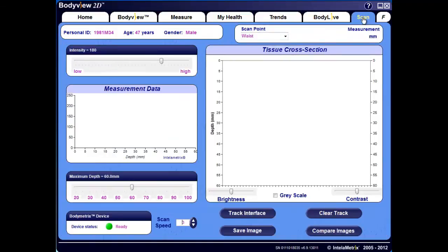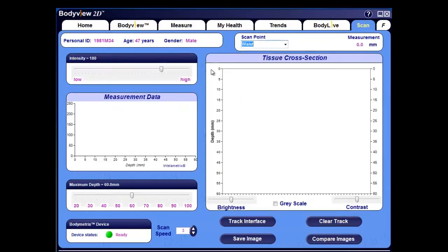Click on the scan tab, and from the scan point drop-down menu, select the waist. Next, adjust the intensity level to 160, as this helps reduce the number of white regions seen, which can be an indication of a saturated signal, especially on more sedentary or obese individuals.